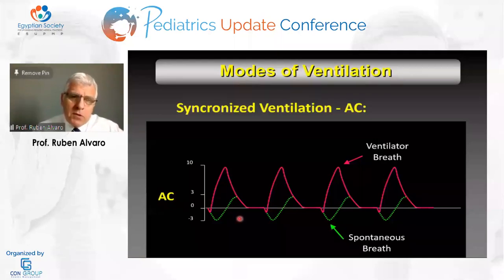Now, there are many reasons why a baby would be breathing so fast, maybe because you're not supporting each breath very effectively. Maybe you're not using the right tidal volume, and the baby needs more support. And in that case, you may actually need to either increase the tidal volume, maybe changing the PEEP, or maybe changing the TI, okay?